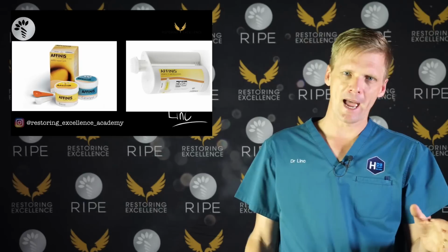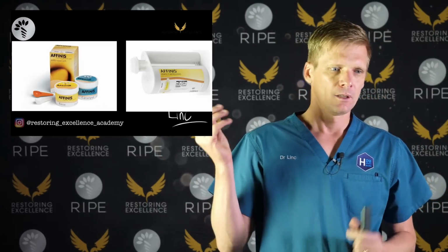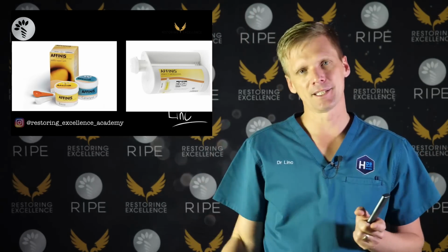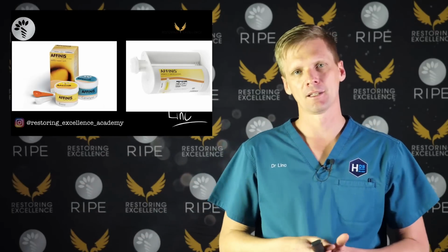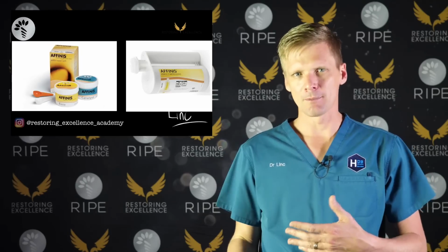Now your preps matter a lot, and I will show you a case later where the preps matter, because if your preps are too divergent, for instance, there's an undercut and the silicone can't flow easily into undercuts. Silicone is dead soft, so it goes straight down or out, but it doesn't go in underneath undercuts very easily. So that's when I would use putty and when I would use heavy body.